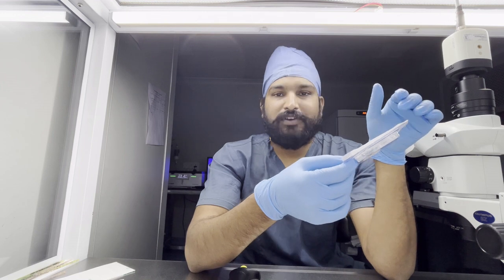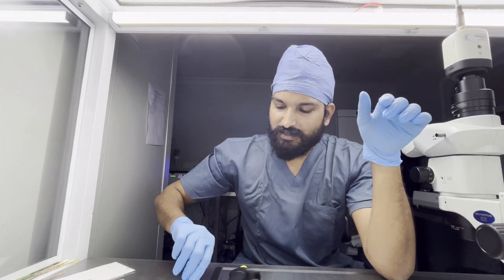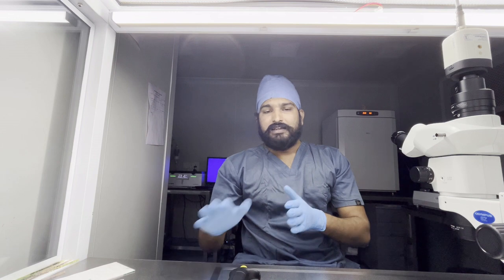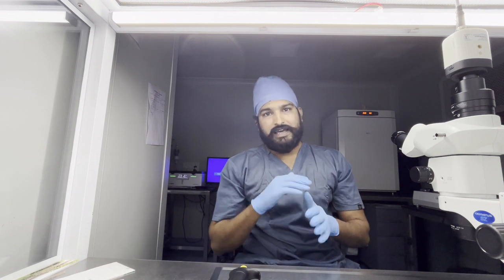This is the Xymote Multi Sperm Separation Device. We use this device generally for those patients who already have had numerous miscarriages, who have high DFI, multiple IUI failures, or multiple IVF failures. In this method, there is no mechanical damage and no centrifugal damage to the sperm. We directly sort sperm using the Xymote method and use this sample for our ICSI procedure.